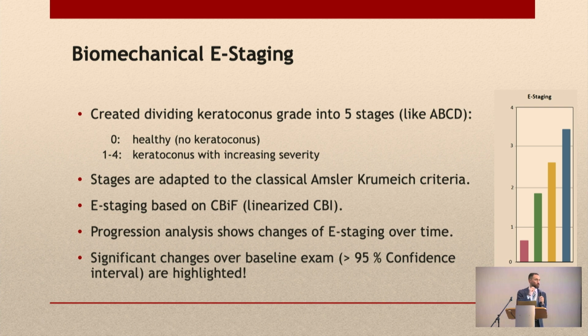Because we have seen that the CBI was created with a logarithmic curve. But if you know a little bit of math, or if you remember a little bit of high school, you can change any curve to a straight line. So if you linearize the CBI, so instead of being a logarithmic curve, you create a linear version of the CBI, which is called CBI-F. Actually, it was first published by Shizuka Ko, in which they called it CBI-beta, but it's pretty much the same thing, so it's a linear CBI.